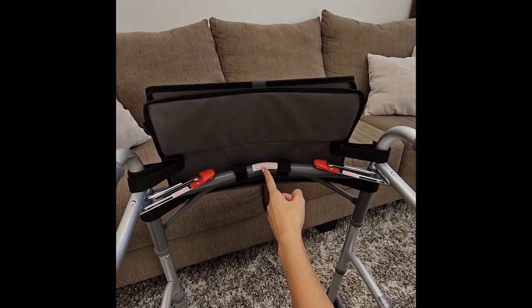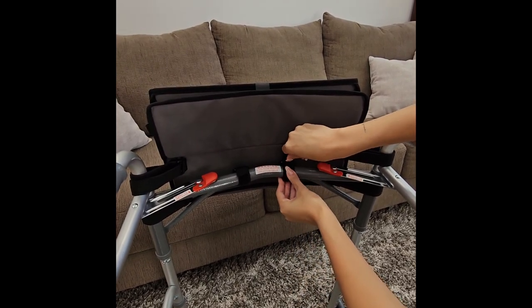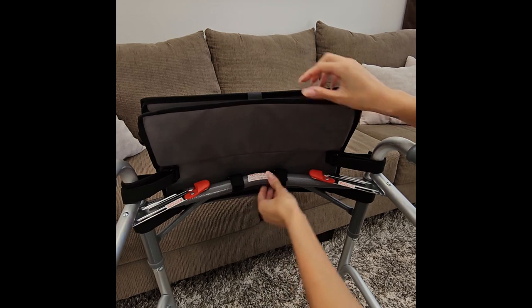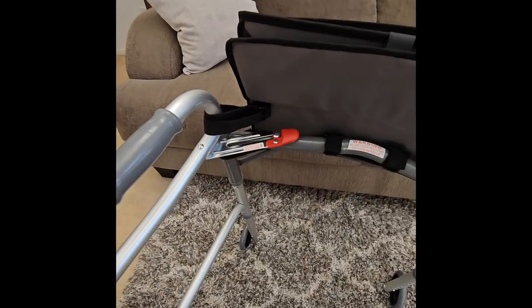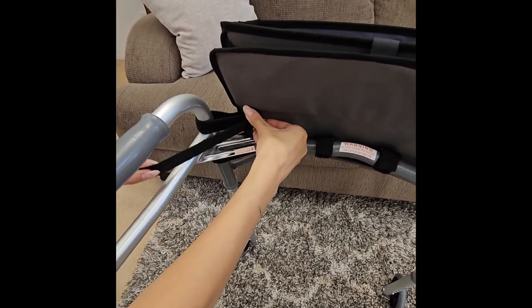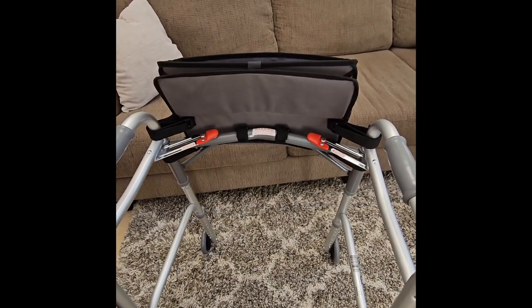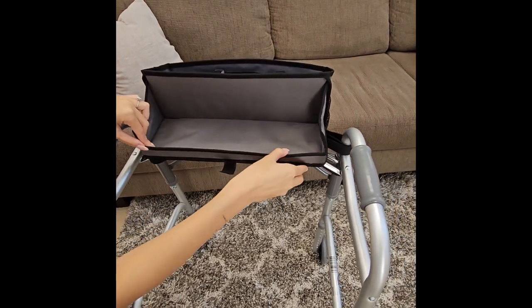Make sure the center straps are still centered. Now make sure all the outer straps are snug but not too tight. You are now ready to enjoy all the features that the Ketland Bay walker bag has to offer.